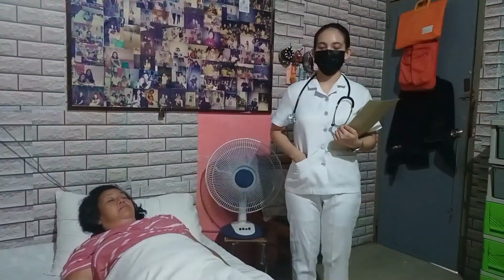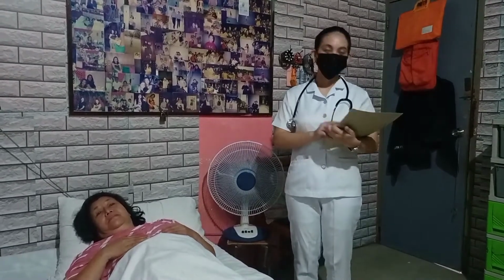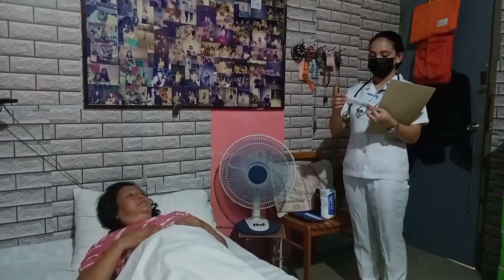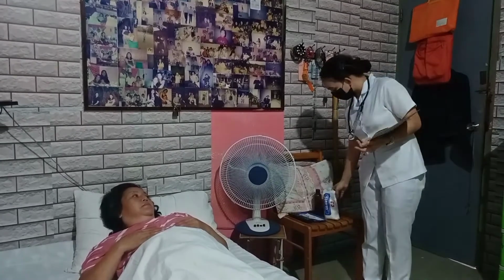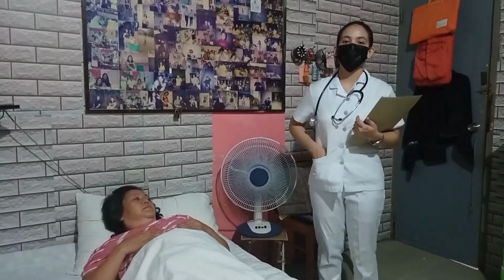Today I'm going to perform the parenteral medication, intradermal case. Check the patient's medical records if available. The second step is to determine which assessment I'm going to do and prepare all the equipment needed: the 3cc syringe that I'm going to use for my patient, the cotton, the alcohol, and of course the medication.